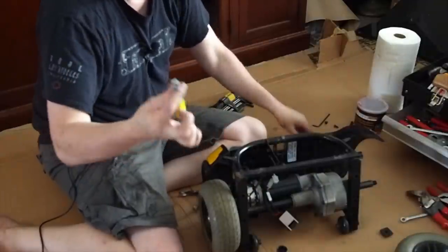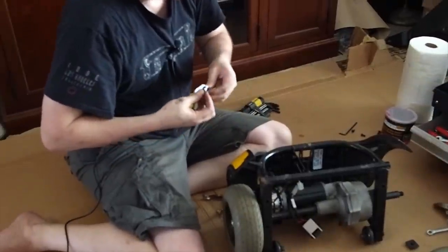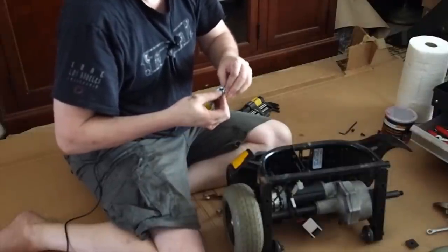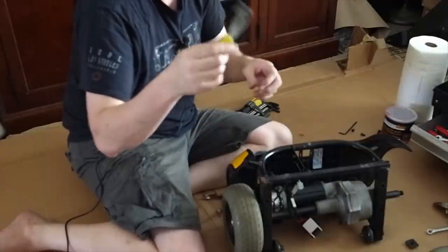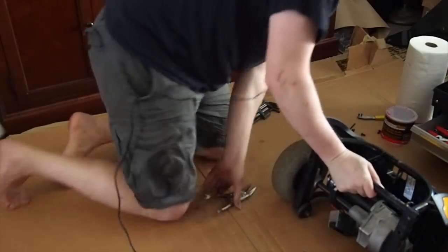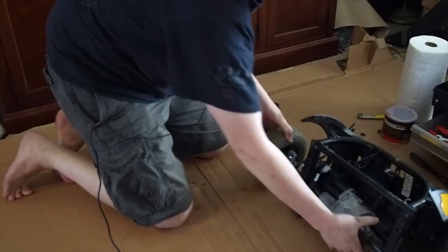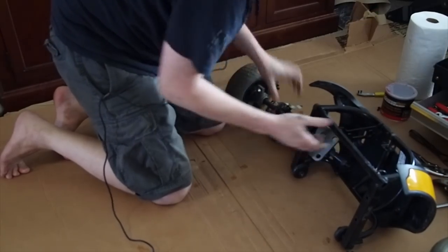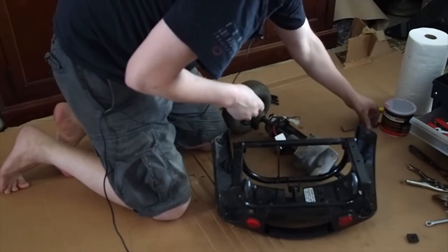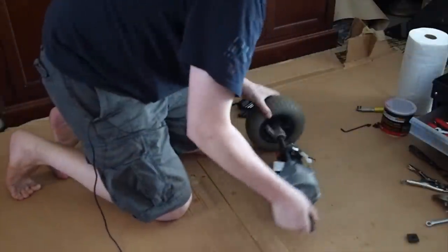Here is the clutch lever. I kind of have to take this off. I wish I didn't have to, but it's the only way I can slide this assembly out. So, clutch lever. I put the little screws in there just so I don't lose them. And now this whole thing should be able to come out here. So this is the back cage. I will put that aside. I won't need that until I'm ready to assemble this thing again.